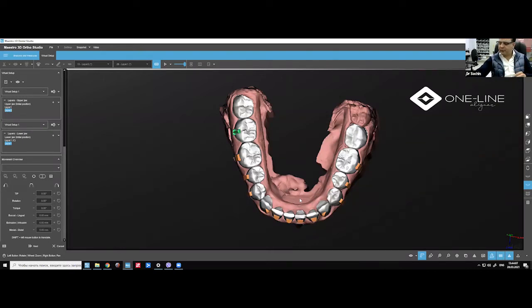So we have a sheet for the technician when we start to make the plan, right? And we have it online also on the database. So we need to write down everything. To avoid too much inventory in the lab, we use right now just one. That is the CA Clear Aligner Pro Plus, which I have seen in my experience works well for almost all kinds of movements.